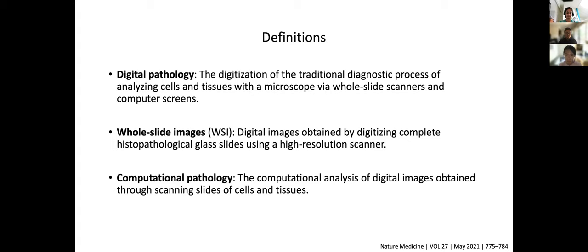So the traditional workflow was, if there's a patient with a cancer, the surgeon extracts the cancer from their body and sends those tissue specimens to a department of pathology. Those tissues are fixed and stained, and the pathologist will examine those slides on a microscope and make a diagnosis or evaluate treatment response.